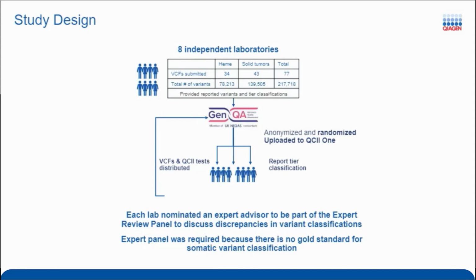So it could have been the case that somebody's variant caller passed something on with a VAF of 4.9, but if it was a 5.0 cutoff, then it wouldn't actually show up in the software for interpretation. Again, this was an effort to make sure everything was consistent across the 8 different participating sites, but there needed to be a line cut off somewhere.